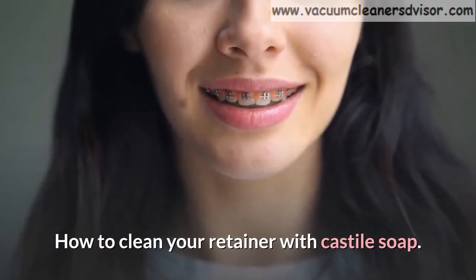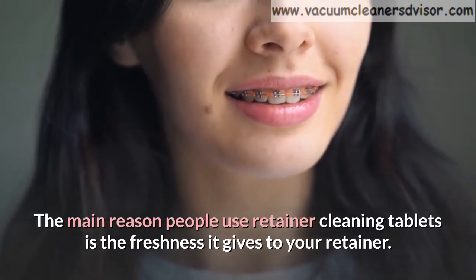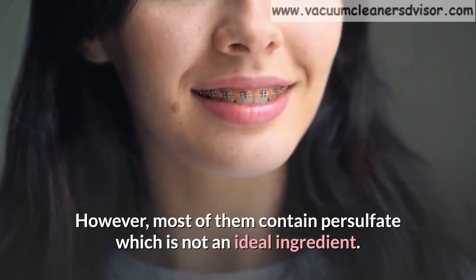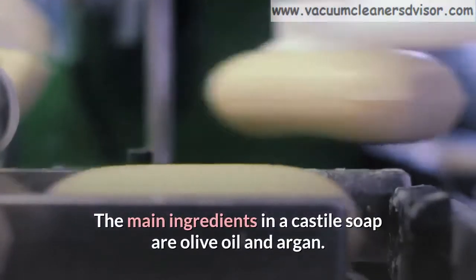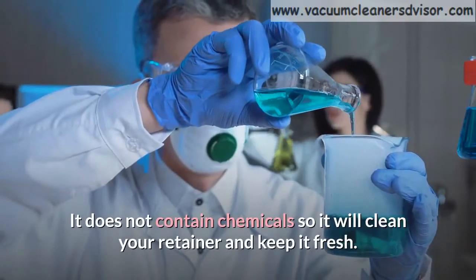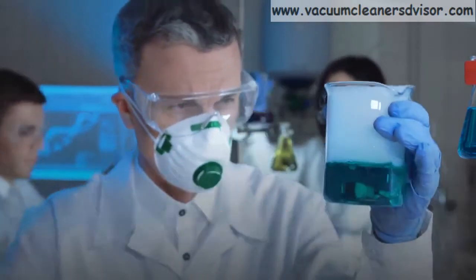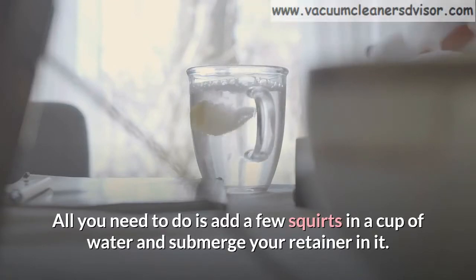How to clean your retainer with Castile soap. The main reason people use retainer cleaning tablets is the freshness it gives to your retainer. However, most of them contain persulfate, which is not an ideal ingredient. The main ingredients in Castile soap are olive oil and argan. It does not contain harsh chemicals, so it will clean your retainer and keep it fresh. All you need to do is add a few squirts in a cup of water and submerge your retainer in it.